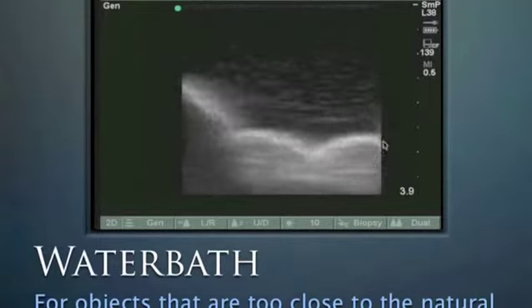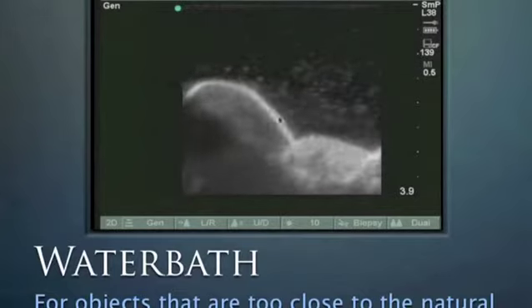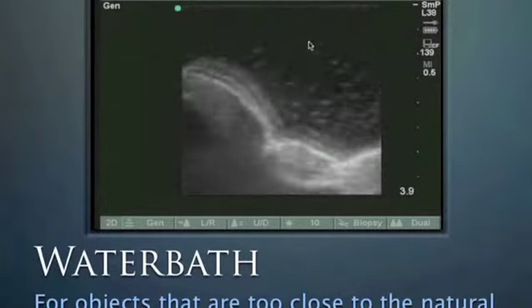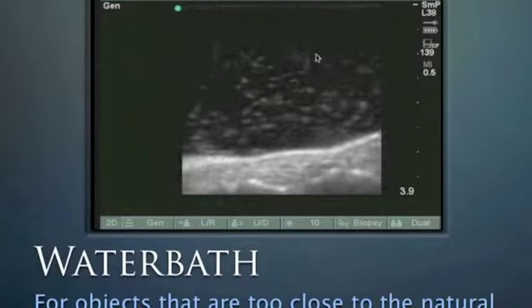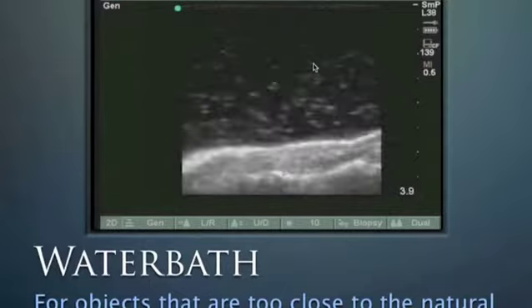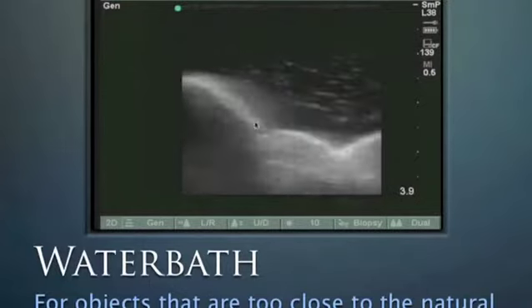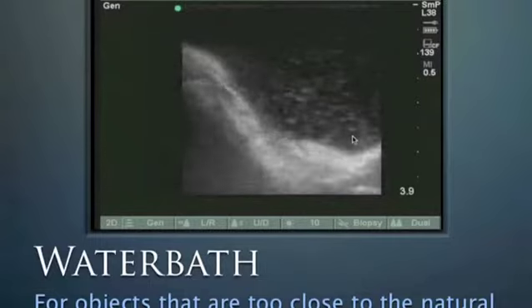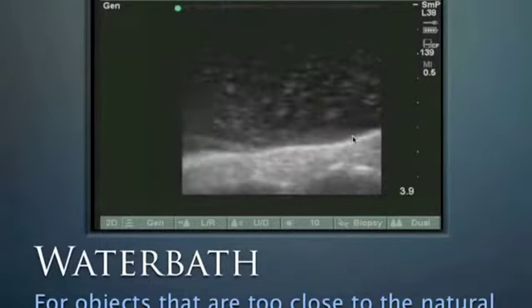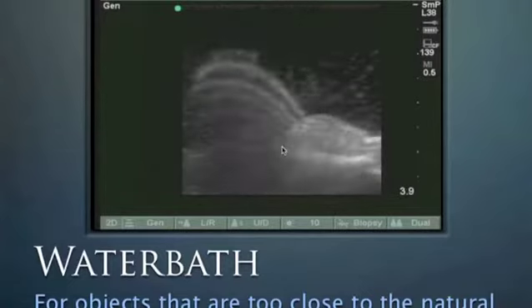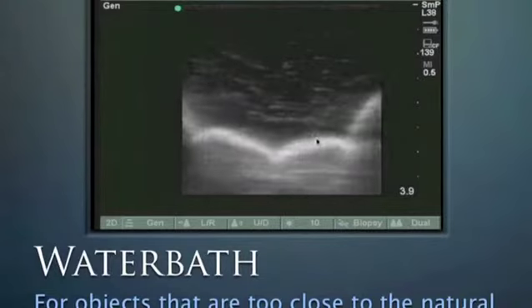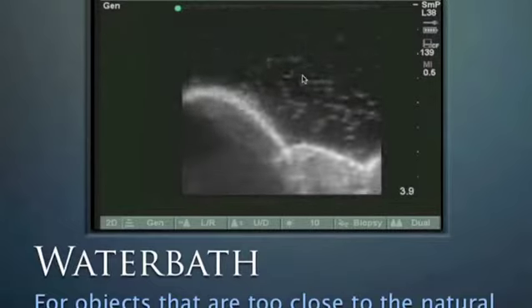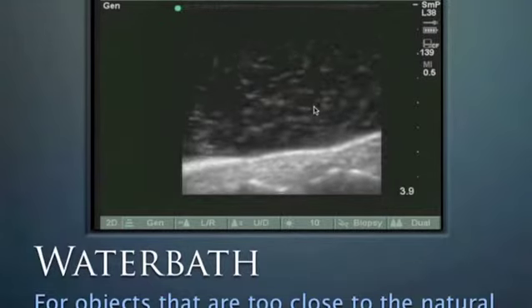This is what a water bath looks like for objects too close to the natural focal point of the transducer. Here's the palmar surface of the finger with specular reflectors — this hyperechoic snowstorm is air in the water that hasn't settled yet. As we stand away from the finger a little bit, we get very good sonography of the entire surface. The water fills in all the nooks and crannies where gel is hard to apply, giving very good visibility of all the articular surfaces.